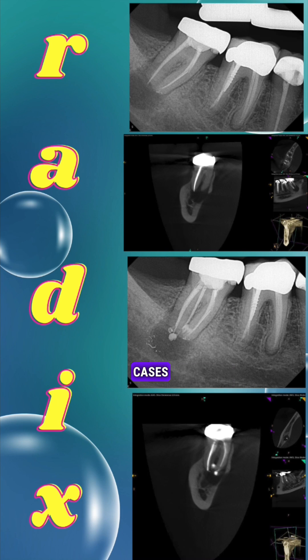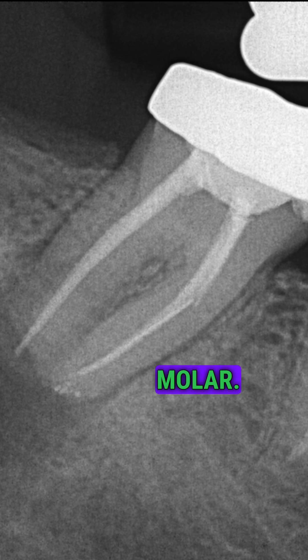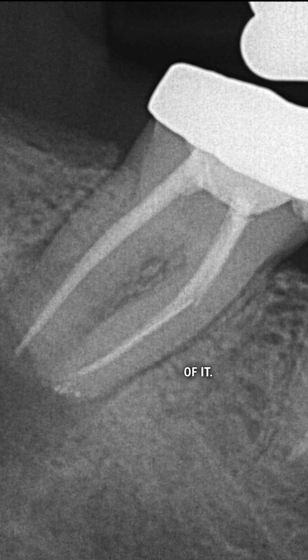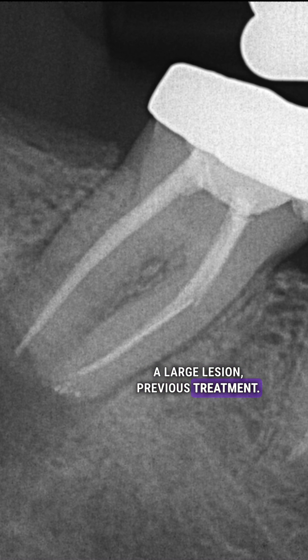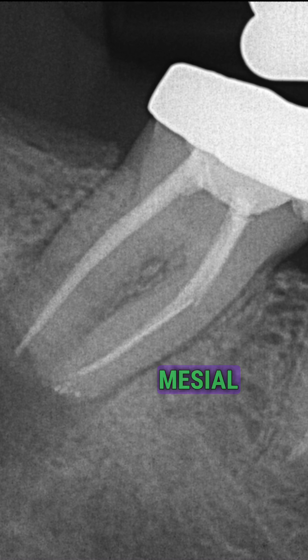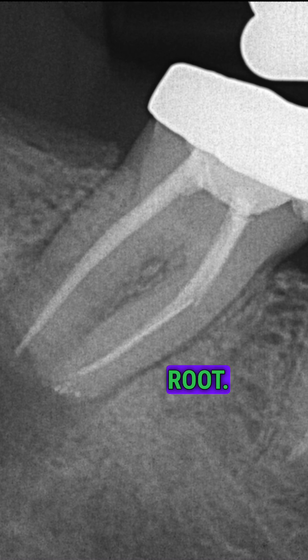I find these radix cases so interesting. A radix is an extra distal root on a molar. Here in two dimensions, you can't see that at all — there's literally no evidence of it. You can see a large lesion, previous treatment. If you look carefully, you can see a separated instrument in the apical half of the mesial root — it was in the mesial lingual. But ultimately, I can't tell that there's an extra distal root.